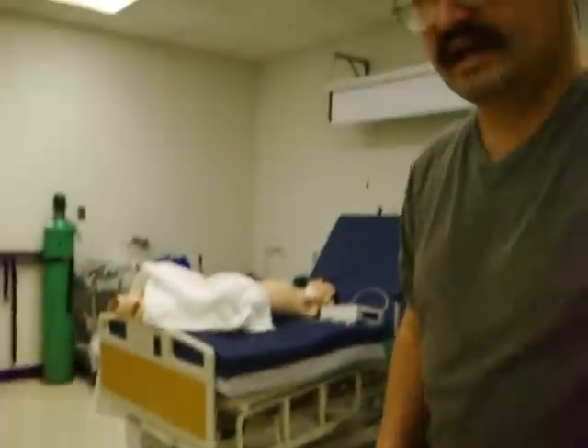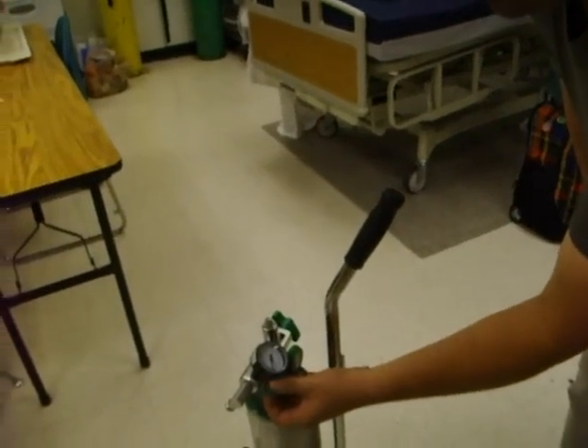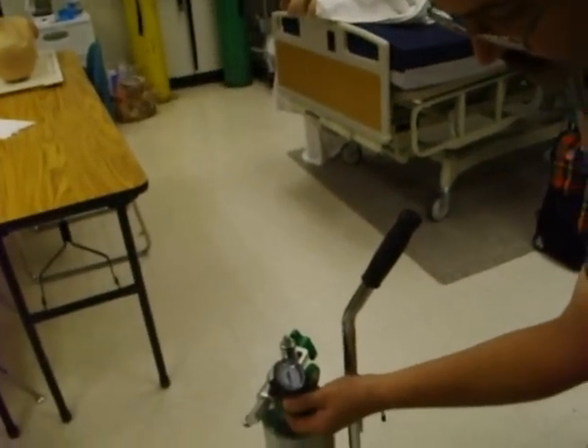We're done with the patient. The patient has been transferred to another hospital, so we disconnect the patient. We're going to turn off the flow, and there goes the flow down to zero.